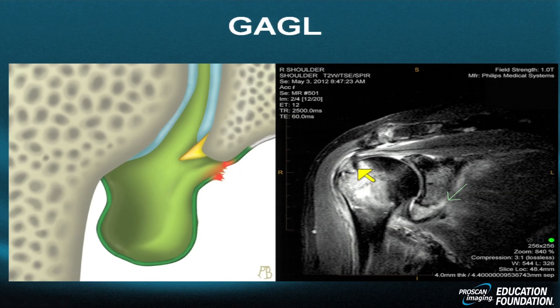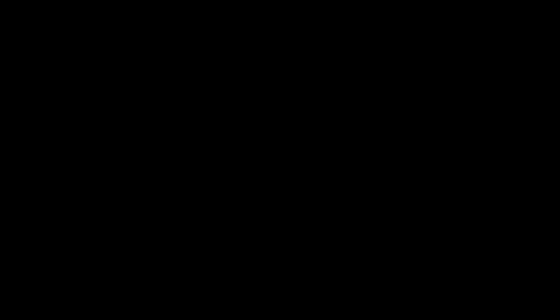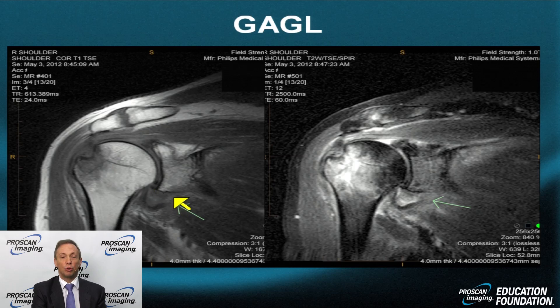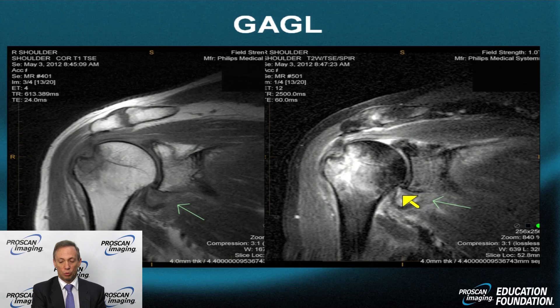The patient also has a nasty Hill-Sachs fracture that is V-shaped like a tomahawk chop, with associated bone edema. Here is the rest of our GAGL seen on a T1-weighted image: our ruptured glenoid portion of the inferior glenohumeral ligament, and our labrum which is hemorrhaged and enlarged — seen better on the water-weighted sequence — in its appropriate position with appropriate relationship to the glenoid. Distention of the capsule and tear of the glenoid portion of the inferior capsule, along with the Hill-Sachs lesion seen as a defect in the superolateral humerus.